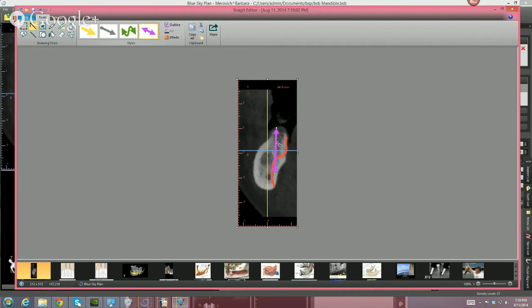But what happens when you put the implant in, instead of the implant being in bone, this is not here because it's really carved out, and when you take a periapical or regular X-ray, it looks like the implant's totally in bone, but in the meantime, you've now gone in 4 or 5 millimeters into the submandibular fossa. If you're lucky, you don't pop anything of significance. If you're unlucky, you hit an artery, and the patient becomes very unlucky at that moment as well. Does anybody have any questions on that?